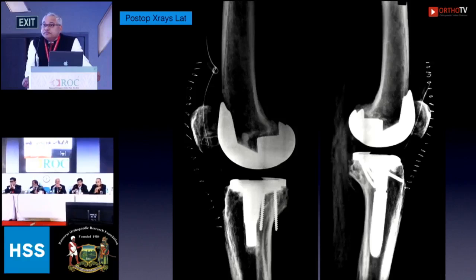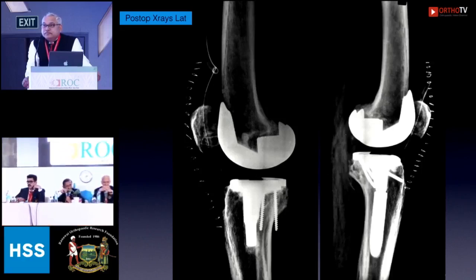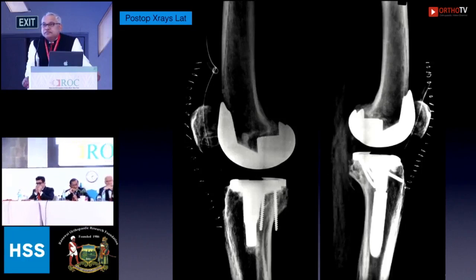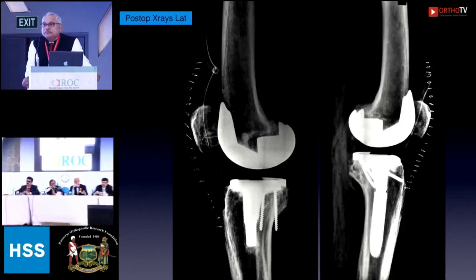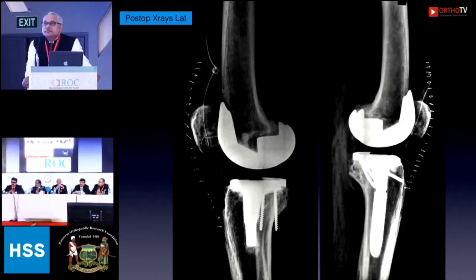Okay, so let's comment on the use of a graft and then the use of a stem. Who likes the idea of using a stem when you graft? We have 1, 2, yes, I do, 3, 4, 5. So I think the whole panel is suggesting that if you're going to use graft, you should cement it and use a stem. So you did the right thing on one side, and hopefully the other side works. It seems like it was a smaller defect.